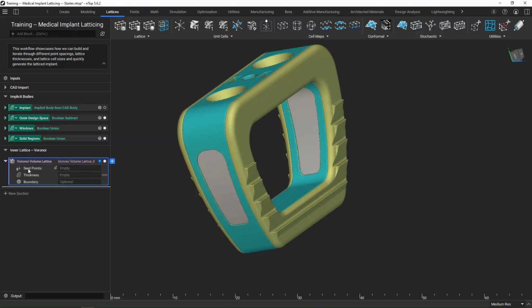And so as we can see, the first thing that it's asking for is seed points. And so because I've done this workflow before, I kind of know which block we want to use from there. But one nice trick that I always like in case I don't quite know where I'm going is I can double click in that input, and then we can see all of the different blocks that work as that input. So I can see, okay, random points in body. That sounds like something that's going to be helpful here because we're filling those implicit bodies. So let me click on the random points in body, and then we have our different inputs to fill from there. So I've got that body.